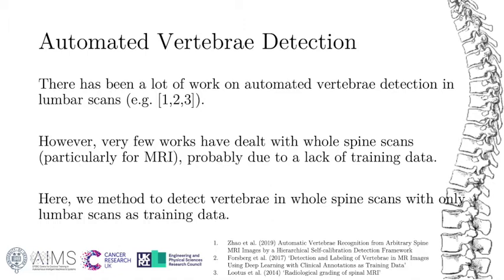And as such, vertebra detection in these scans is very important if we want to achieve automated diagnosis in any of these diseases. Here, we propose a method to detect vertebrae in whole spine scans using only lumbar scans as training data.